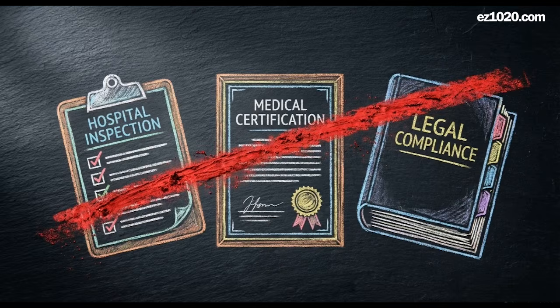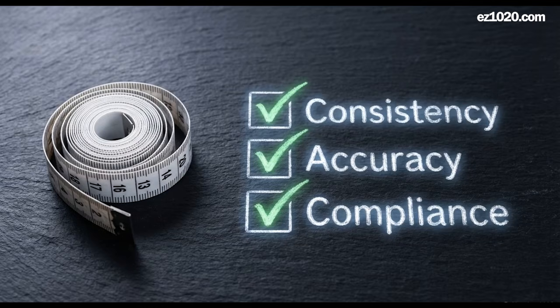Sloppy placement carries external consequences. Failing to measure affects lab accreditation, invalidates credentialing exam standards, and strips away medico-legal defensibility under ACNS guidelines. Proper proportional 10-20 measurement using a physical tape measure provides the only defense against these cascading clinical failures.